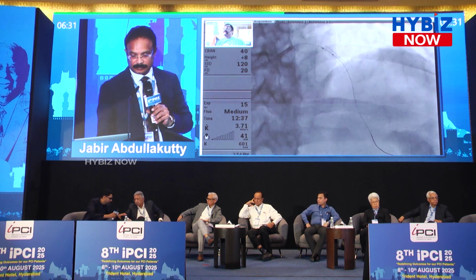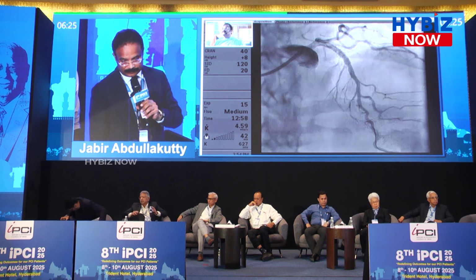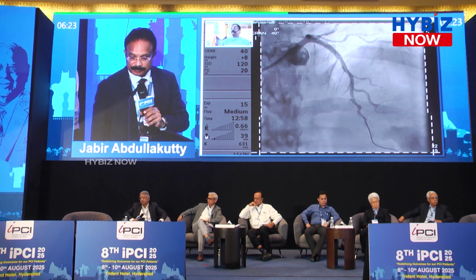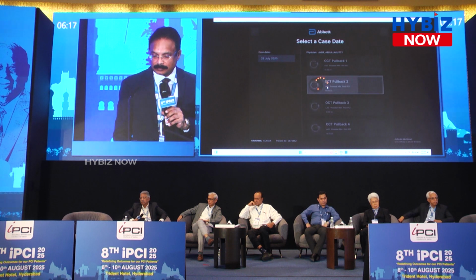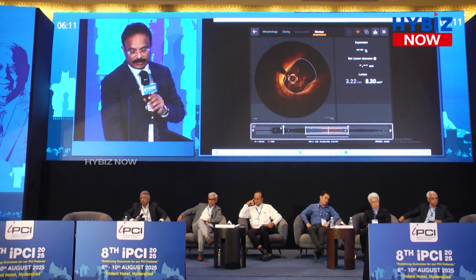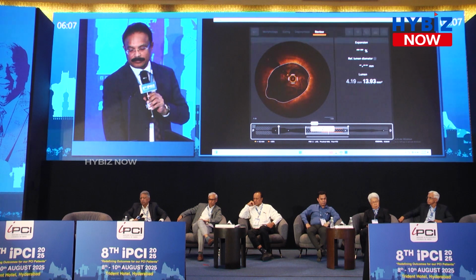Go. This is a 4 millimeter balloon. We post dilated with a 4 millimeter balloon and took another run of OCT. This is the second run of OCT after post dilatation with only the proximal part of the stent post dilated with a 4 millimeter balloon.